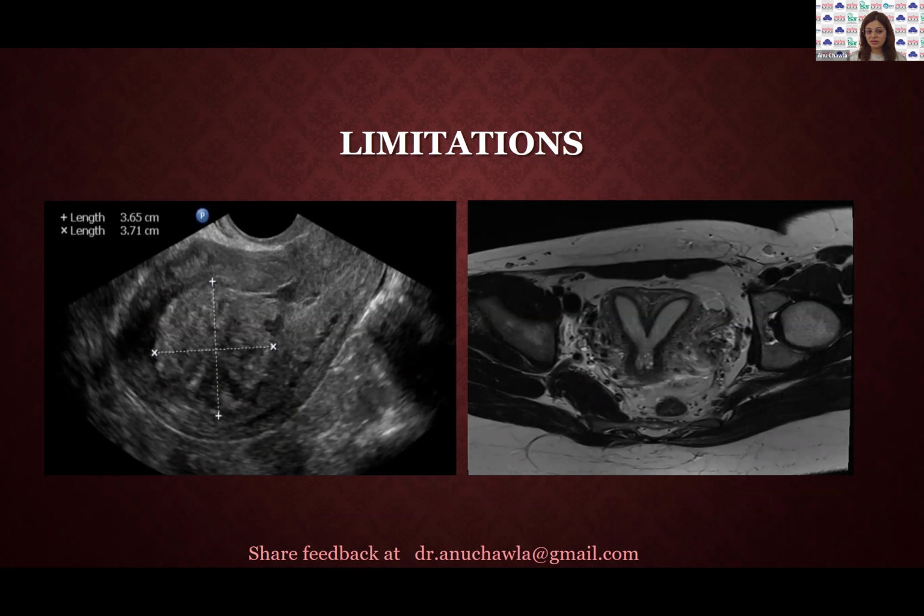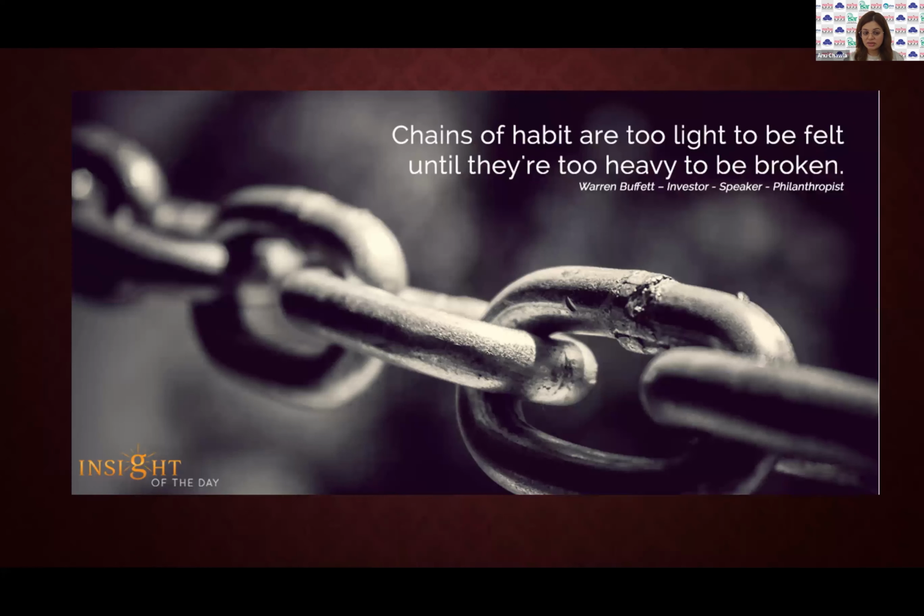So these are the examples of those cases where office hysteroscopy obviously cannot be used. So the patient selection: simple cases, small polyps, diagnostic, directed biopsies should be the ones based on which we can, in the beginning, convert some cases who don't need to wait for the ORs, and especially the travelers who come from all over the place to a particular fertility center, you can do office hysteroscopy for them.